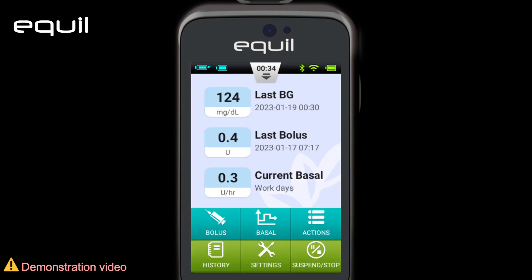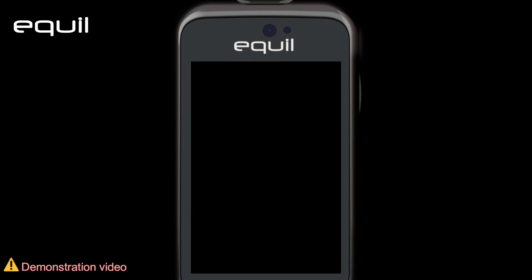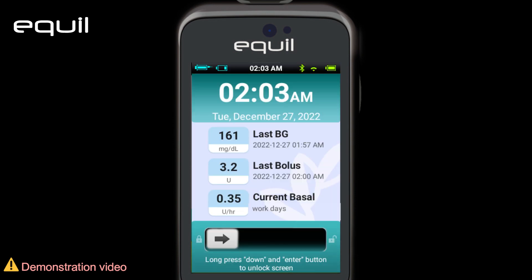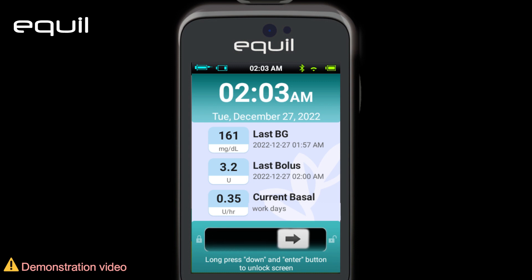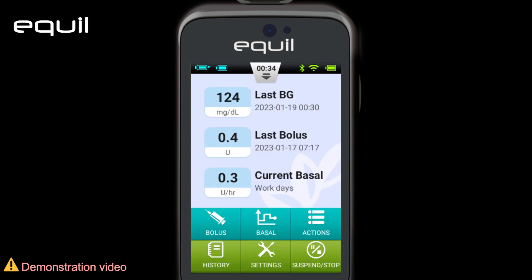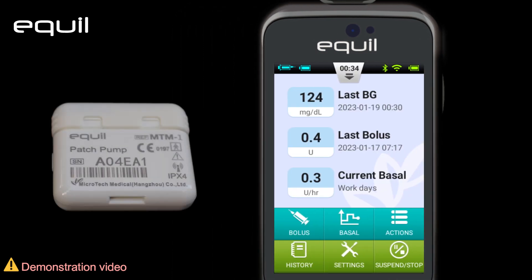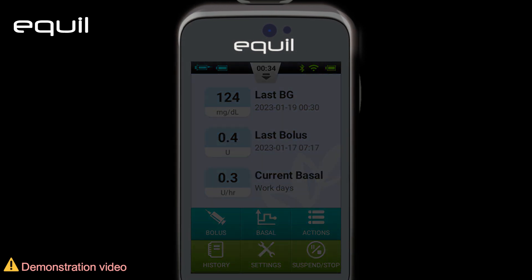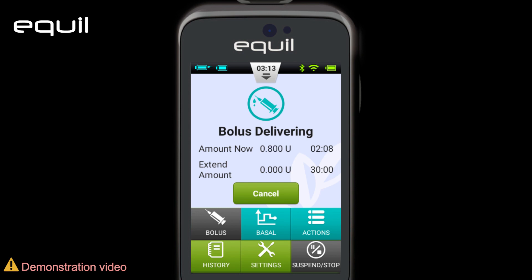We can turn off the PDA display from the Power button, or it automatically turns off after the preset screen timeout. When we press the Power button again, we'll see the lock screen. To unlock, pull the lock bar from left to right, then enter the password. In case we forget the password, we can enter the pump's serial number. It's worth noting that when the screen is off, the pump is functioning properly.